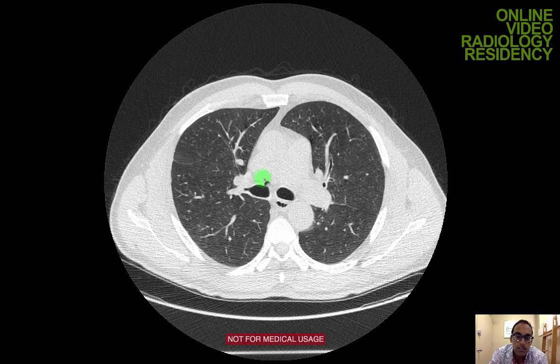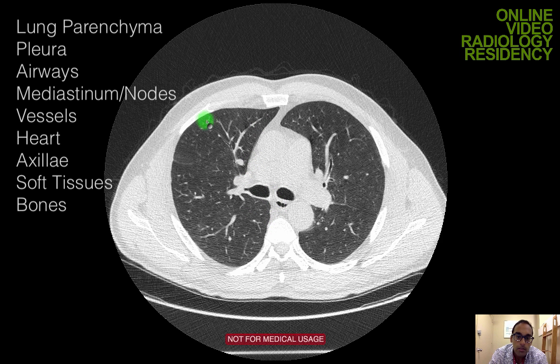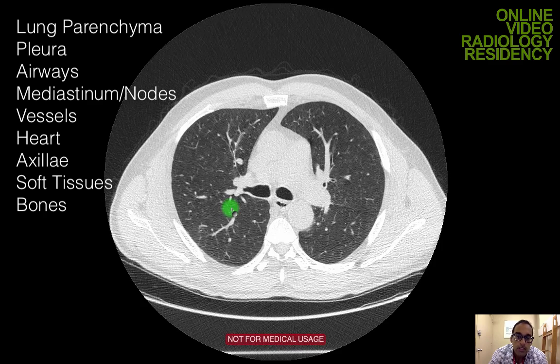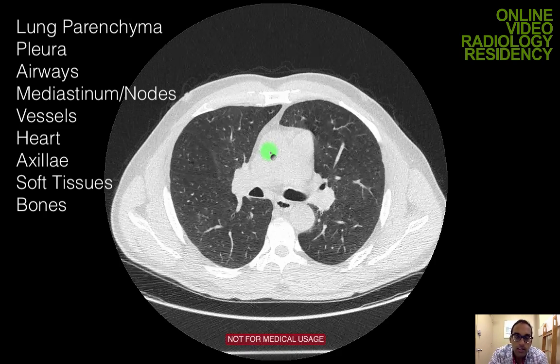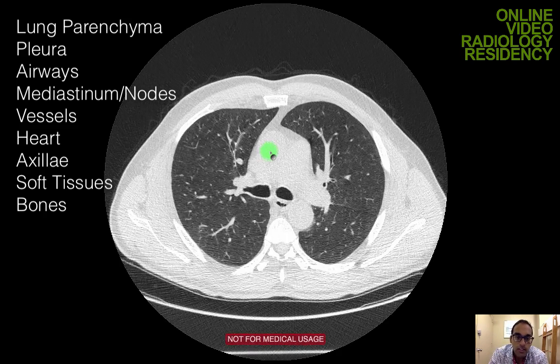With the chest, I basically split it up into lung parenchyma, pleura, and airways. I also split up the mediastinum into mediastinal fat and nodes. I look at the vessels and the heart. Then other things I look at: the axilla for nodal tissue, the soft tissues including the muscles, and lastly the bones.